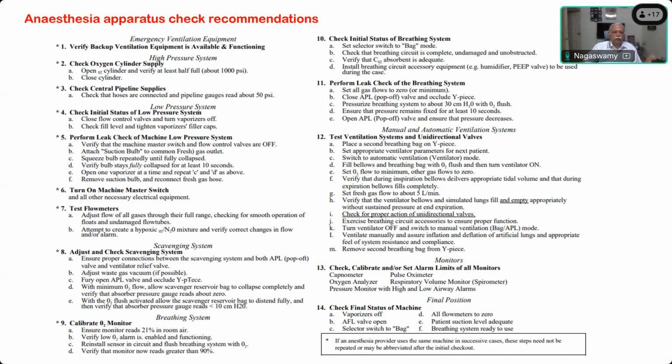And then of course she described all the things, how to do the checking, how to do the various things, switching on the machine. Modern workstations all have a master switch. So unless you switch on that, the equipment won't work. And make sure that the spare backup battery is fully charged. That also is displayed.